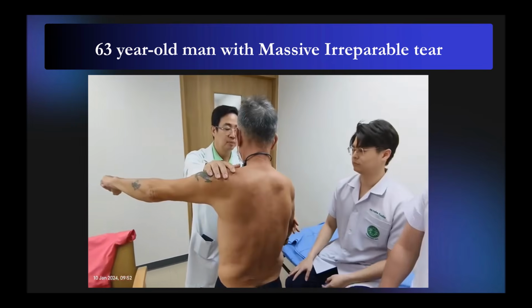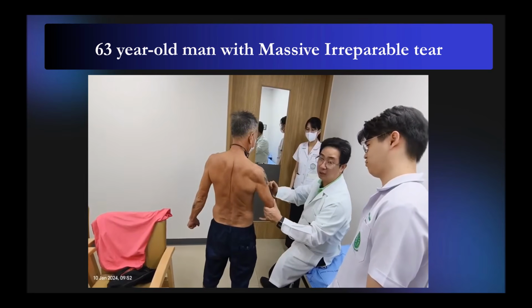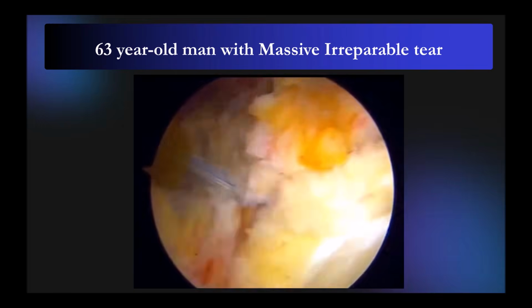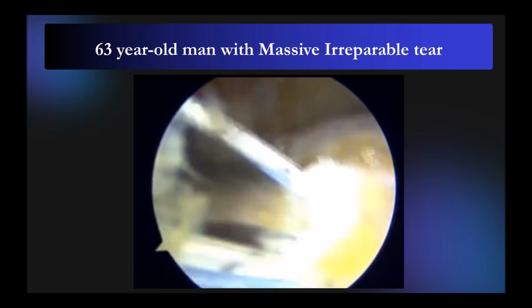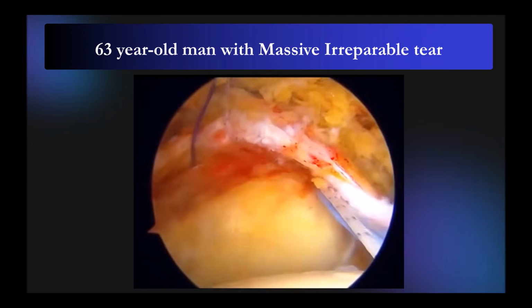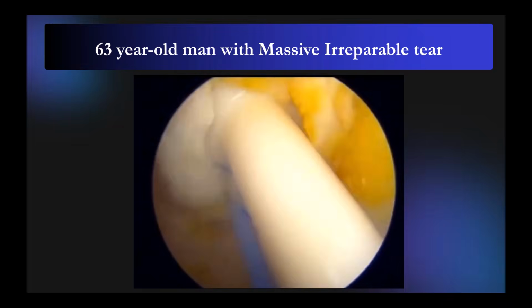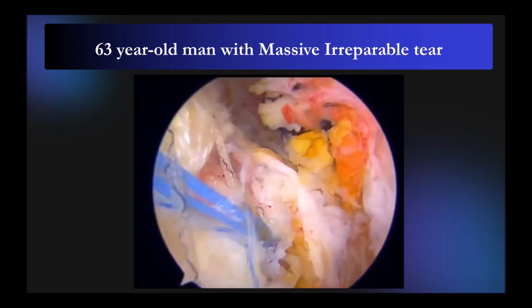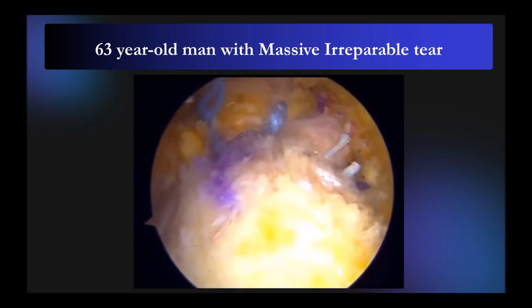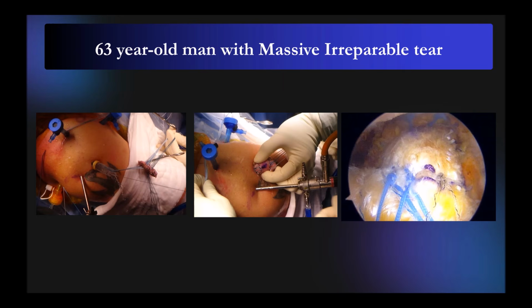So this is a 63 years old, the supra-infra. Very big tear, same things, right? We make SCR, we make 12 sutures, put it in. And the rest of the cuff is always on the top again. I repair the stump of the rotator cuff to my graft. This is autograft, right? You can see it is on the top.